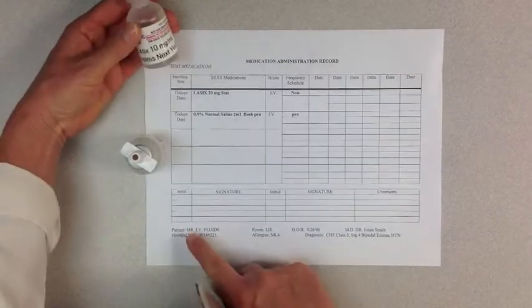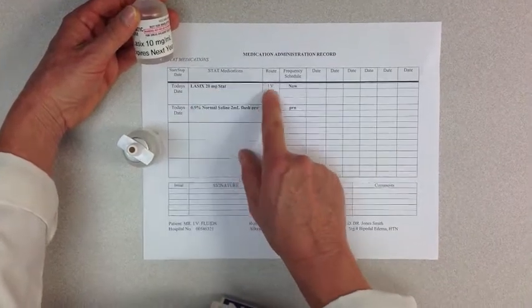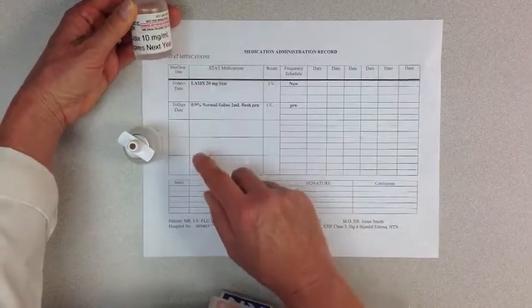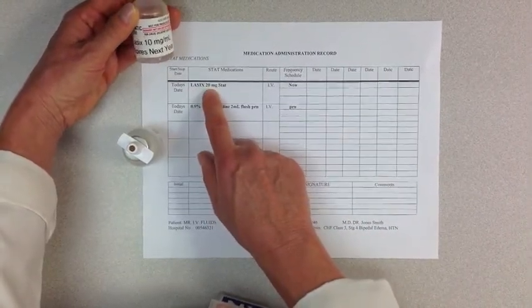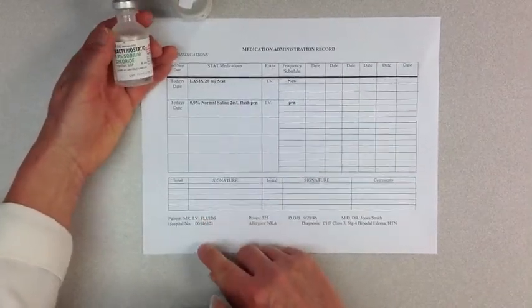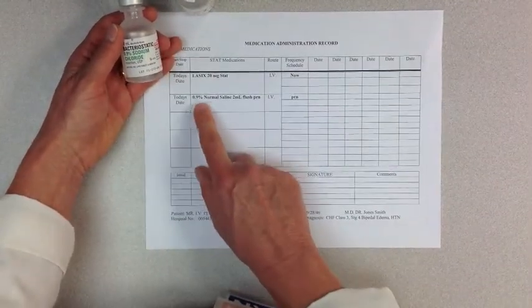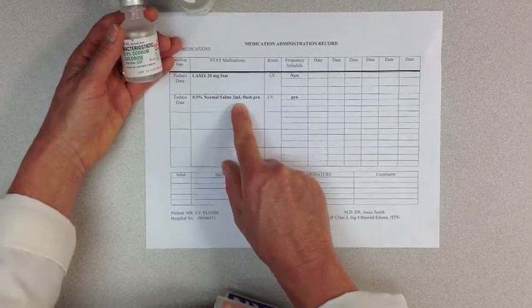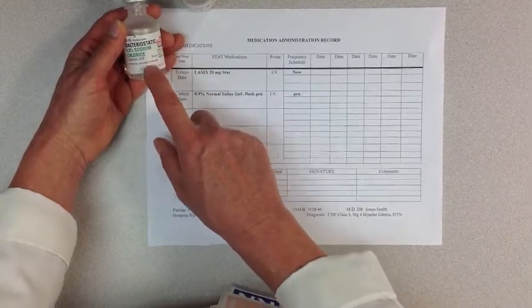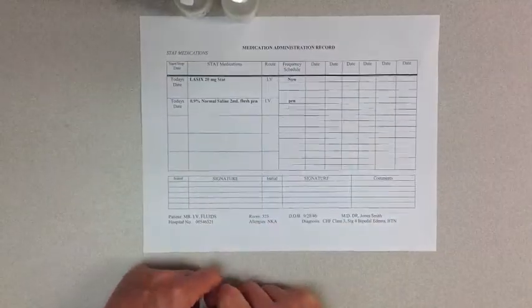Second check for Mr. IV Fluids, today's date, Lasix 20 milligrams stat IV, due now. In my hand I have Lasix 10 milligrams per ml. I will draw up 2 mLs to equal 20 milligrams. Second check on the med is done. Second check on the sodium chloride. I have Mr. IV Fluids, today's date, 0.9% normal saline, 2 ml flush, PRN, IV. And I have 0.9% sodium chloride to be given IV for Mr. IV Fluids. Second check is complete.